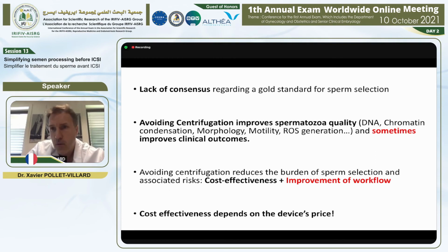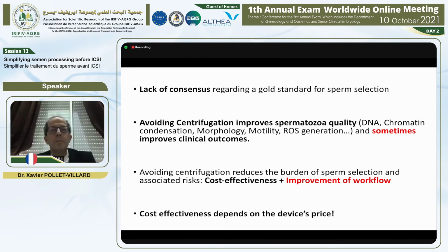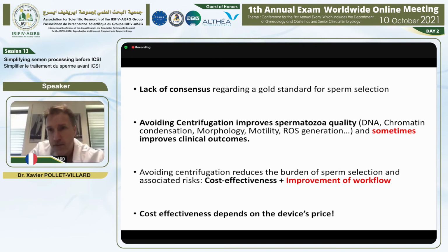But what is certain is that avoiding centrifugation reduces the burden of sperm selection and also the associated risk of mismatch, for example. So it's very cost effective if the device is not too expensive. And the main thing is that it's a dramatic improvement of workflow in the lab.